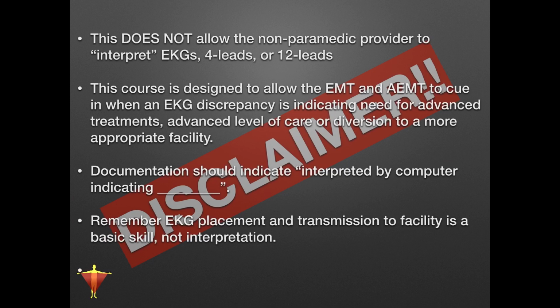We also want to remember that EKG placement and transmission to a facility is still a basic skill, just not interpretation. So remember that at the basic and intermediate levels, absolutely, placing an EKG, placing a 12 lead is still a basic skill and an intermediate skill. It's not just a paramedic skill. And that can be sent over to whatever facility it is you're taking that patient to, and maybe even let that doctor make that determination.